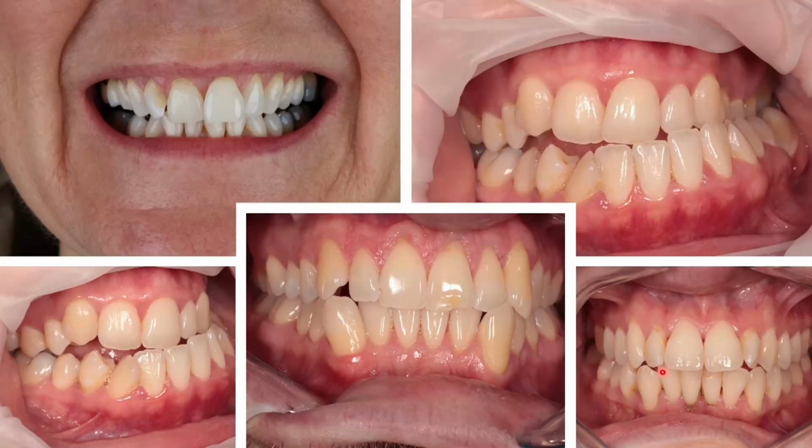This would be a relatively high risk case for movement after any alignment phase, and so this is the kind of issue with gums that you certainly would want to think twice about taking on. The periodontal issues would certainly need to be resolved before you were able to assess that properly. For me, that case was not one that I was happy to filter into my clear aligning workflow.